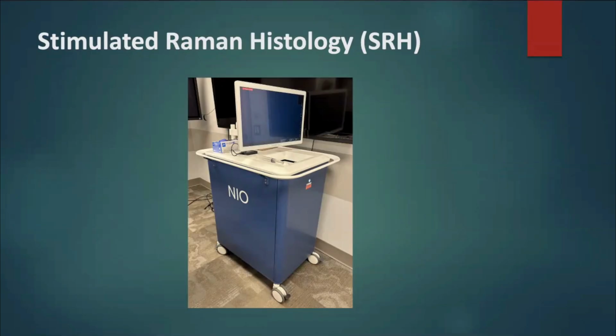Now, several AI Raman convolutional neural networks have been developed and tested and compared with histopathological specimens. The SRH images are of 3 by 3 or 5 by 5 millimeter tissue. Pseudocoloring is applied to mimic the appearance of H&E, and the scan time is around 5 minutes. So the question is, can this be leveraged to help answer some of the questions posed today?